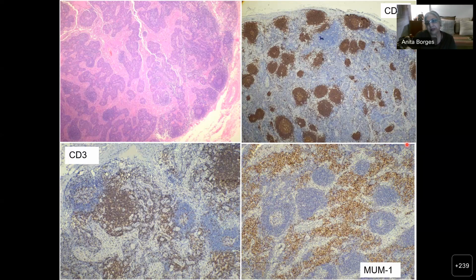MUM1 is a good marker of plasma cells. It's a good marker for many other things, for example melanoma. But in the context of lymphoma, MUM1 is also expressed in some lymphomas, and also in Reed-Sternberg cells, but in routine, normal lymph nodes, it is expressed in plasma cells.